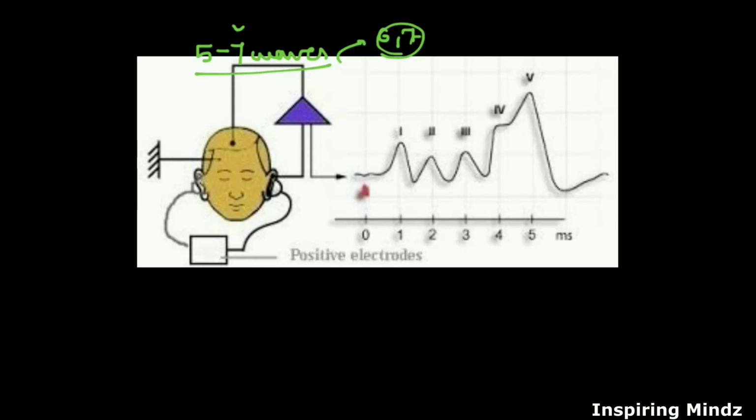So from which electrical stimulus are these waves formed? This is important for us. So let's discuss. We can remember this with the same mnemonic, that is E. coli, but here we have to increase one E. So we remember it as double E. coli. By the first E, I mean the distal portion of the 8th nerve. By the second E, I mean the proximal portion of the 8th nerve.